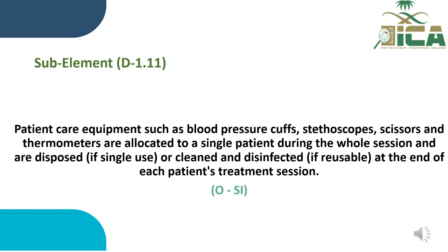Sub-element D1.11. Patient care equipment such as blood pressure cuffs, stethoscopes, scissors and thermometers are allocated to a single patient during the whole session and are disposed of if single use, or cleaned and disinfected if reusable, at the end of each patient treatment session. It is determined by observation and staff interview.